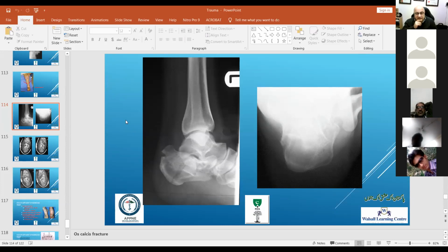It's nearly flat, isn't it? So why do we need to know these angles? Basically to classify the fracture, as there is axial load, so there is a depression of the calcaneum by the talus. They tell us whether we need to fix this or not.